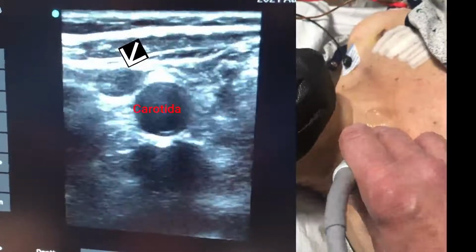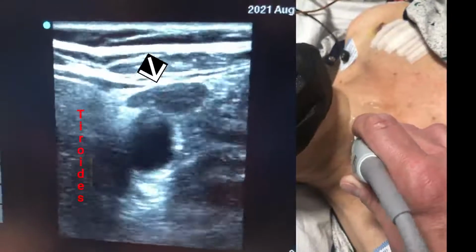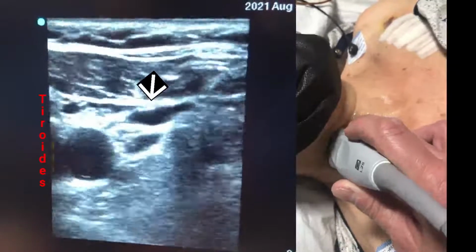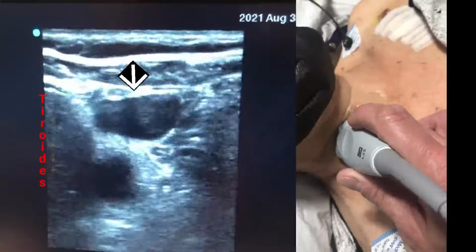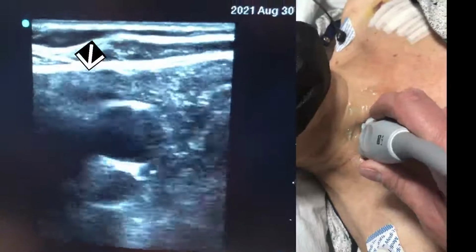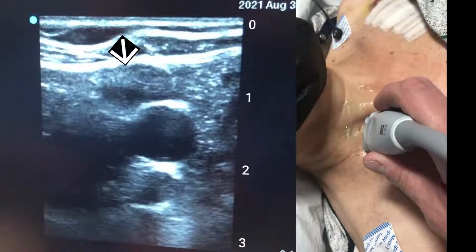This case signals how easy it is, by anatomical landmarks, to potentially have a problem. Now we're moving up in the neck. See the jugular vein. We see an anterior jugular vein that split a few seconds ago, and we see a nice compressible jugular vein moving higher up in the neck, close to the jaw. And again, moving down the neck a little more. Again, a long clip, playing it back and forth just to underscore the importance of the finding in this patient. So you see the carotid and the jugular vein on this patient.